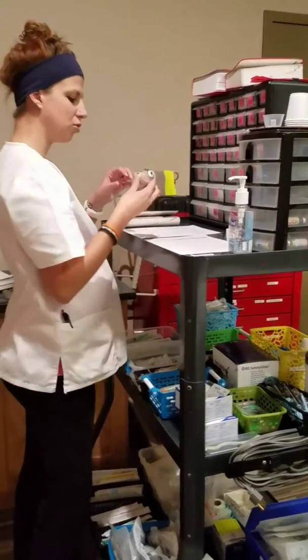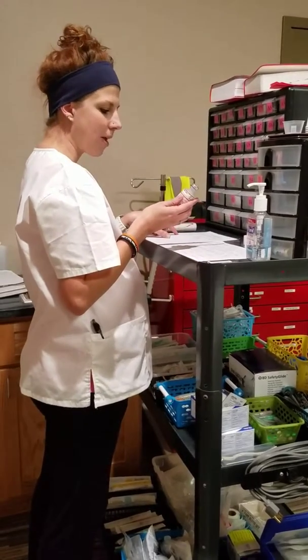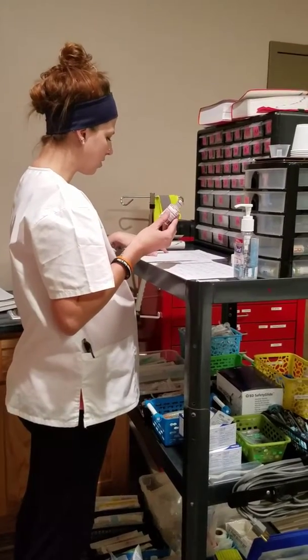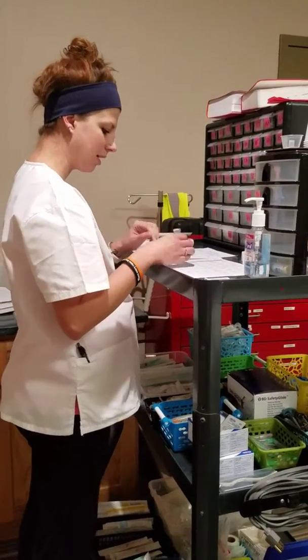I'm going to do my triple check — Hydroxyzine, Hydroxyzine, Vistaril, which is Hydroxyzine. The bottle is labeled 100 mg in 2 ml, but we are only ordered to give 50 mg, so I'm going to only be injecting 1 ml today.